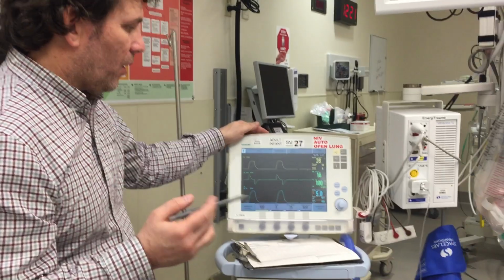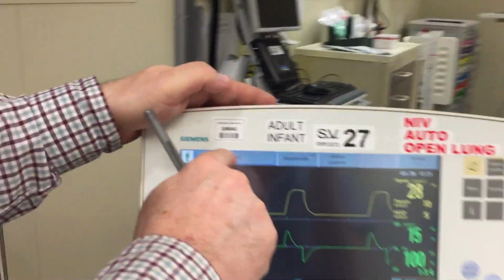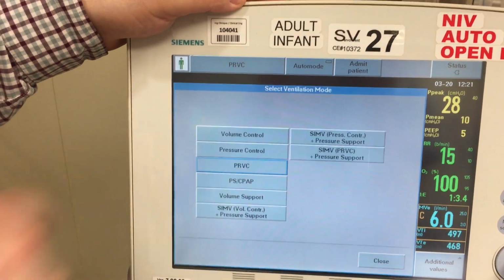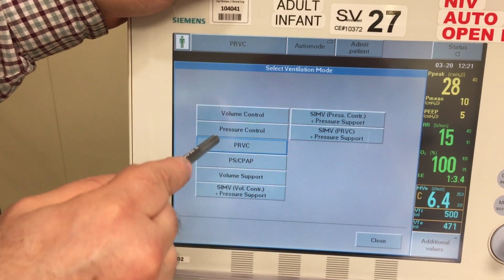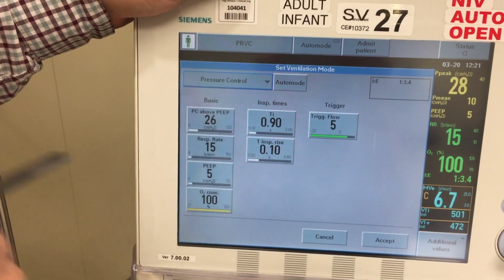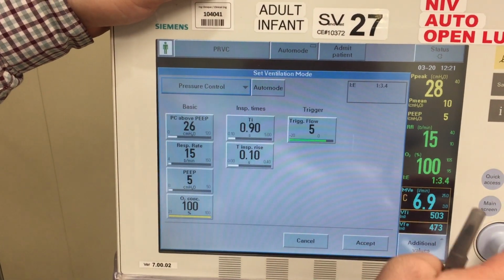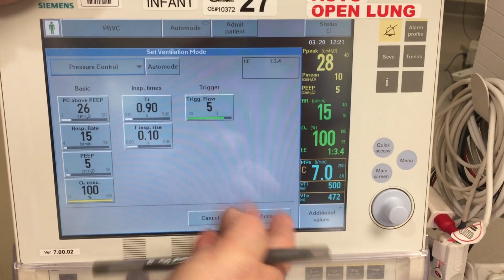If you did need to change your mode for whatever reason, again, we'll default to PRVC, but you can just hit the PRVC button. Then if you want to go to a different mode, you hit PRVC up here again, and then all the modes come up. In this case, we want to go, for example, to pressure control ventilation, so we would just click on that. Once you change something, if it's just the mode, you can hit accept or hit the toggle button here. You just push it in. It's probably just as easy to hit accept on the screen.